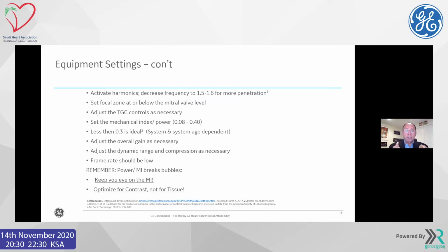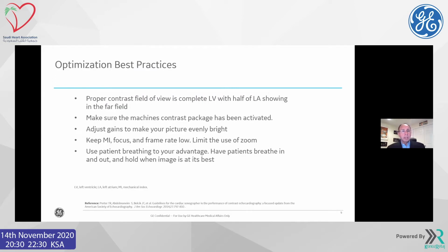Optimize your contrast for tissue. I mean, optimize for contrast, not for tissue. I said that. So optimize all your settings to optimize the contrast settings, and I'll show some pictures here in a minute, not for tissue. Some other best practices you can see: when you have the proper contrast field of view, complete with your left ventricle, it's opacified beautifully. It may be showing half of the left atrium. That's okay, because the focus is in the left ventricle.